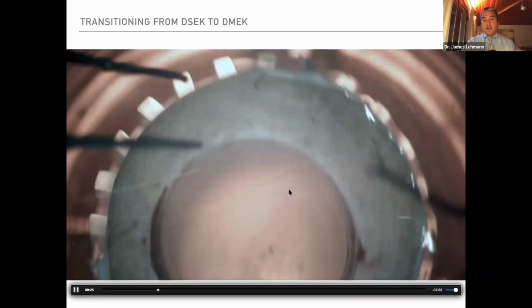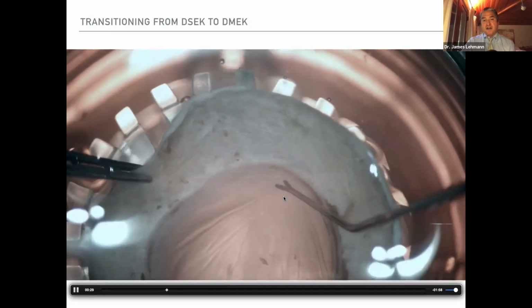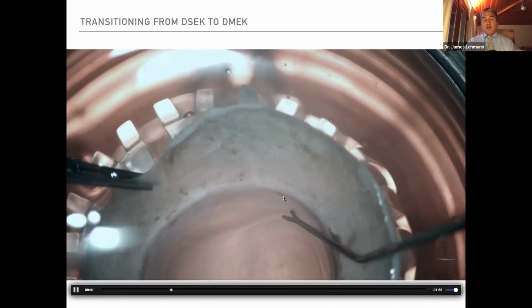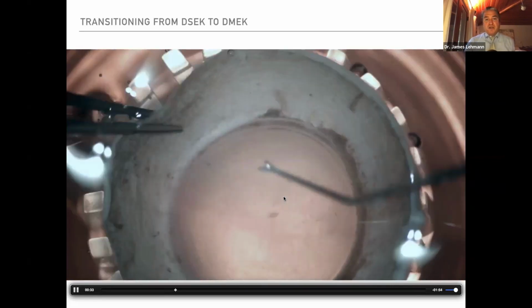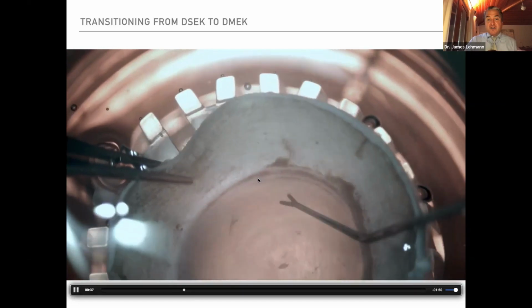Now I'm going to start speeding up the video. And you're scoring Descemet's all the way around here. Now, what's the point of this? This is where you're going to get that edge, okay? And there's going to be some tags that happen where some of the tears start to run a little bit.